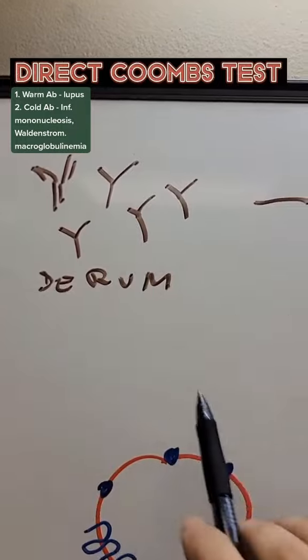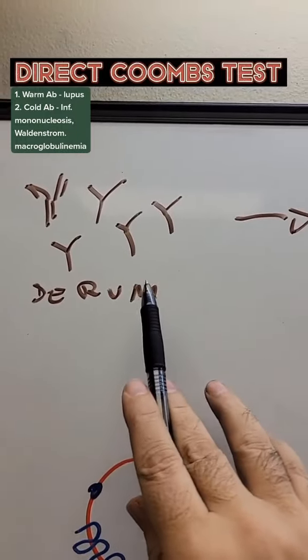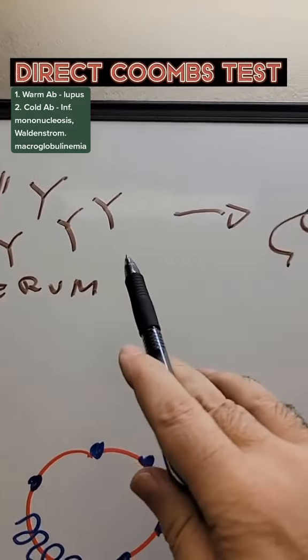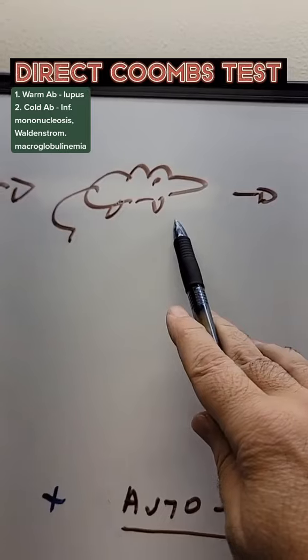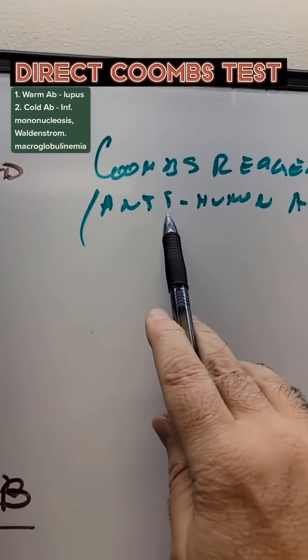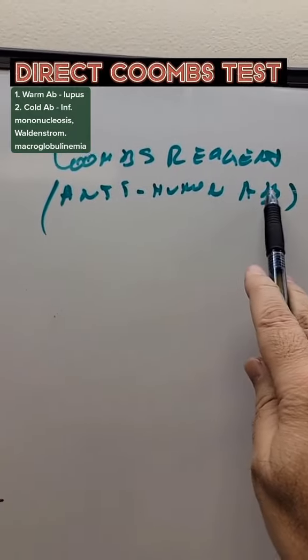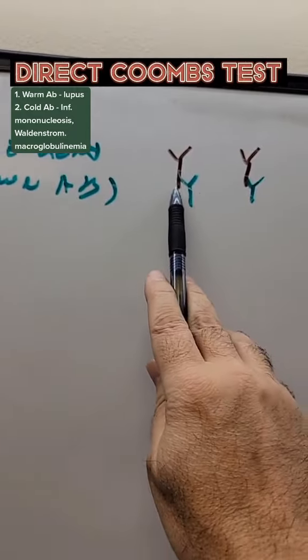So if we have a normal serum from any person, it will contain all sorts of antibodies in it, which are proteins. So we can take these proteins, we put them in a mouse, and the mouse is going to create anti-human antibodies or anti-human globulins, something that we call a Coombs reagent, and they will bind like this, the green ones.